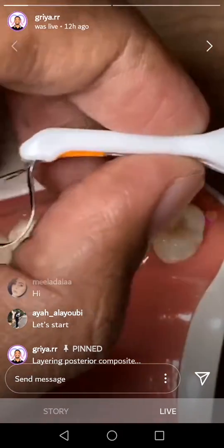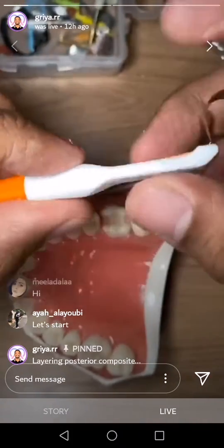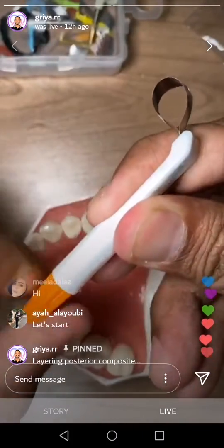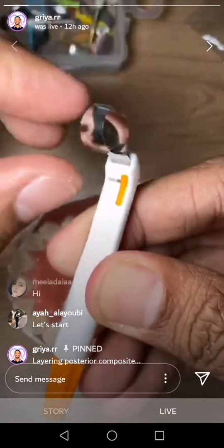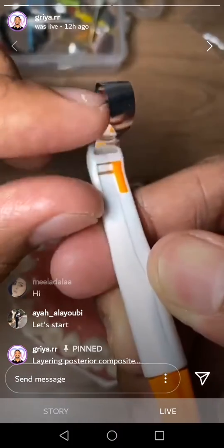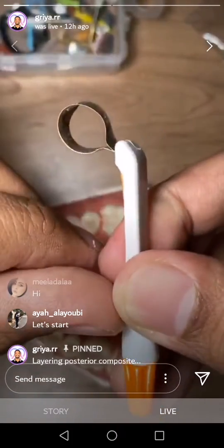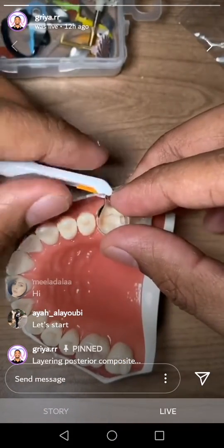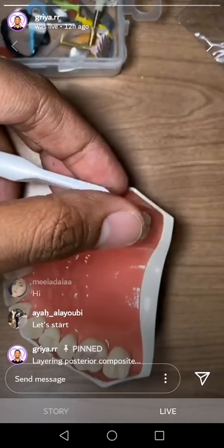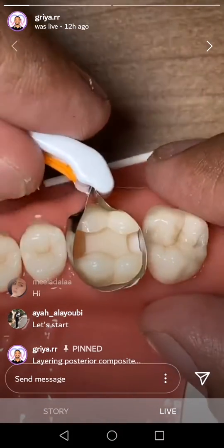So I will show you how to put in this matrix. You can make a big loop first, and then you can bend like this. So you can try to put it in here.